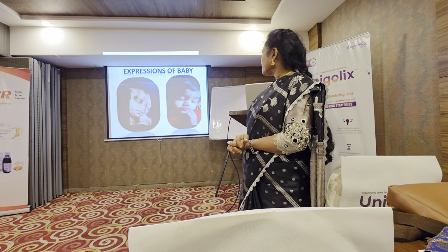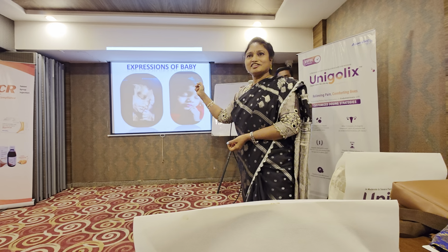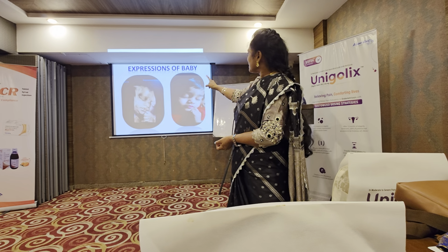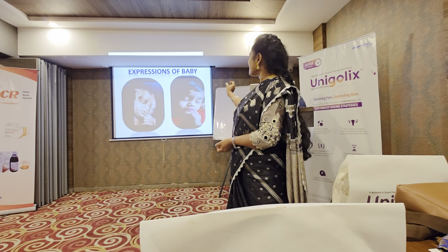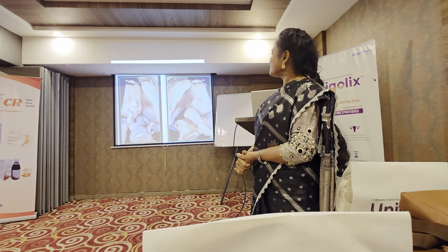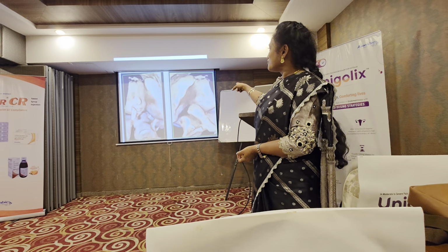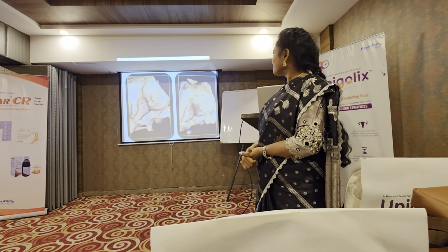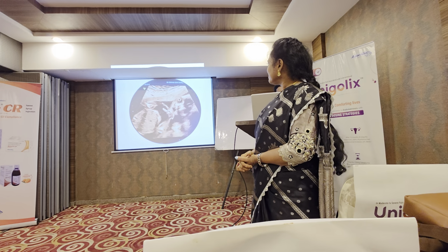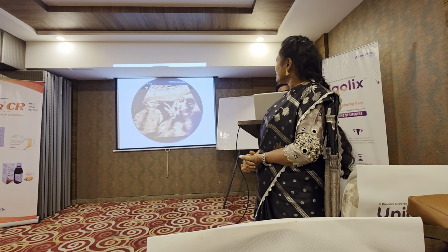Next one. That's it. So these baby expressions, I really find them so nice and exciting. This baby was like this in the 9th month, and after birth it had the same nose and the same lips. Next one. See the baby in the 9th month, it's very fun watching them. Different expression, that baby was thinking, smiling. Next one. So see, that baby was drowsy. Next one. See, this baby was thinking with an open mouth.